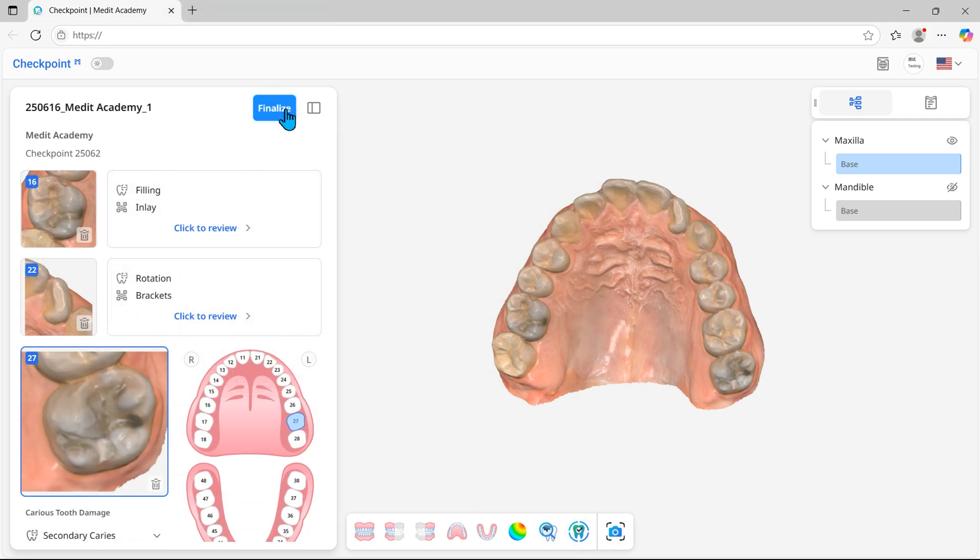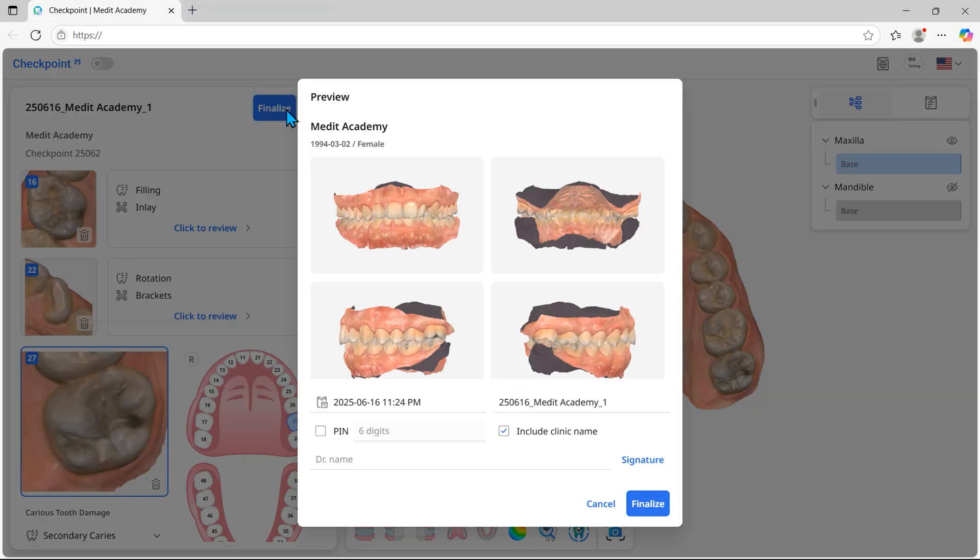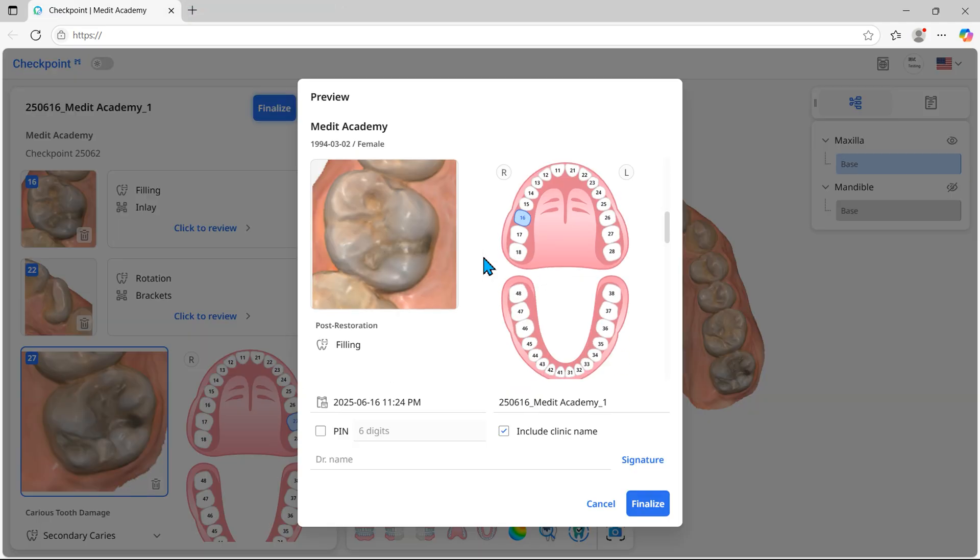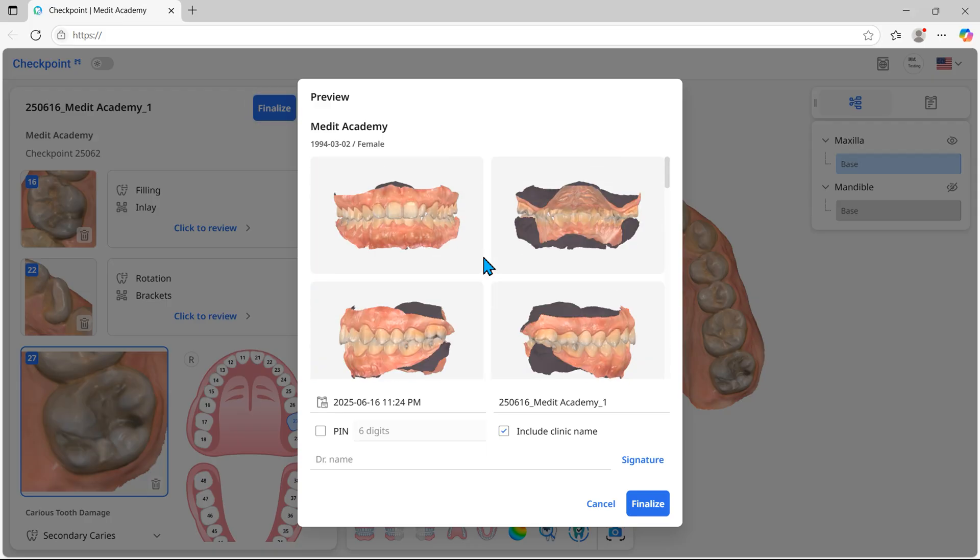After entering all data, click Finalize to preview the report. Fill in the report name and choose whether to include the PIN code and the clinic name.